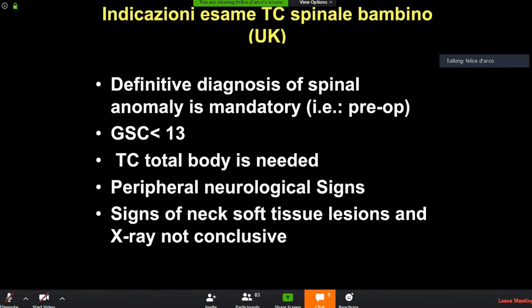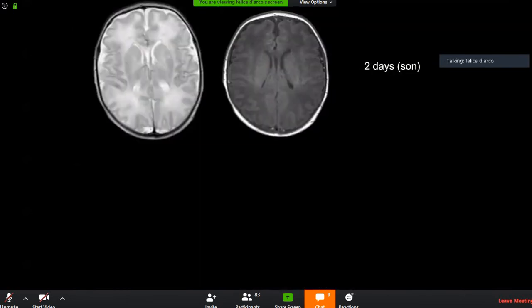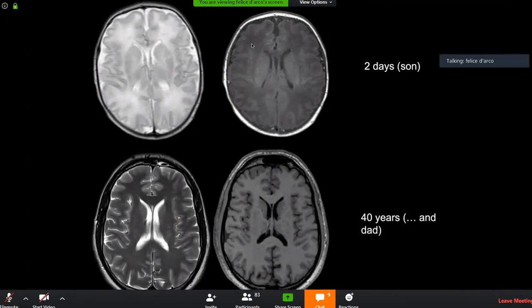These indications are mostly guided by the NICE guidelines, which you can download from the UK. Regarding myelination: on T2 an adult brain is fully myelinated — white matter is low signal on T2, bright on T1, and low on FLAIR. In a two-day-old neonate, without myelination, white matter looks like water — hyperintense on T2, hypointense on T1. Over time T2 signal darkens and T1 brightens as lipids and proteins accumulate in the axons.